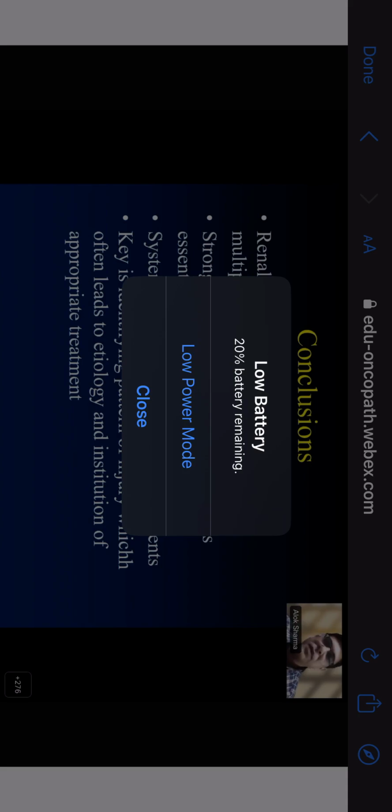And it is a very systematic approach. Most specialized biopsy algorithms have a specialized approach, and so does renal biopsy. The key here is identifying the pattern of injury, again, pattern. I'm re-emphasizing the pattern, which often leads to the etiology, and not only the etiology, but the pathophysiology and the overall outcome. The most gratifying part is that when you give a diagnosis, it will change the patient's life forever. That will direct the whole way the patient will be managed.